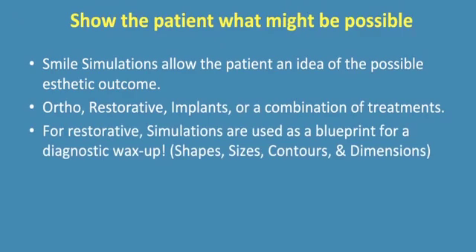When the patient says, that's what I want, then it's up to the dentist and the lab technician using Smile Vision to help achieve those results. In the laboratory, we use simulations as a guide for our diagnostic wax-ups. We actually measure shapes and contours and dimensions of teeth when we're doing our diagnostic wax-up phase.